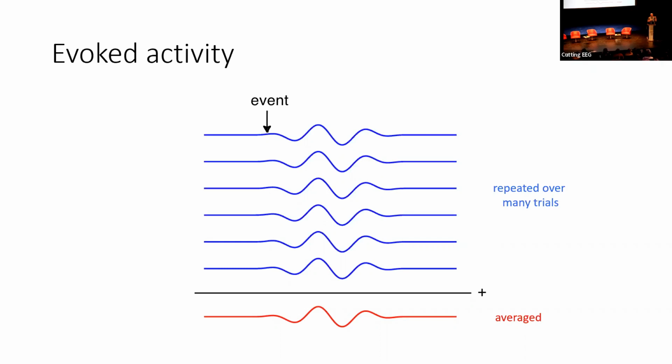At a certain moment, you have this trade-off between the within-subject variance and the between-subject variance. Getting more and more trials from your individual participants is at some point not going to benefit the statistical power in your design, because it's going to be limited by the variance between subjects. But if you have very few trials per participant, then that is going to be the limiting factor.